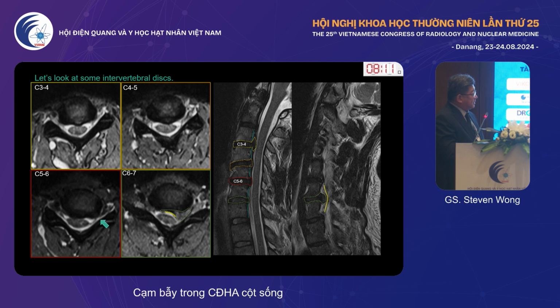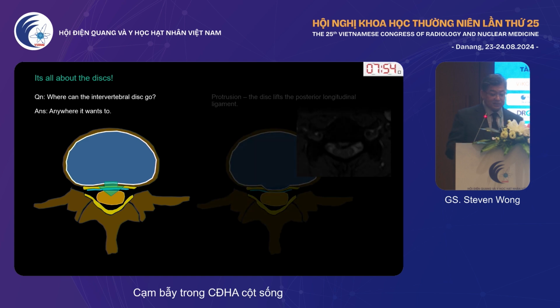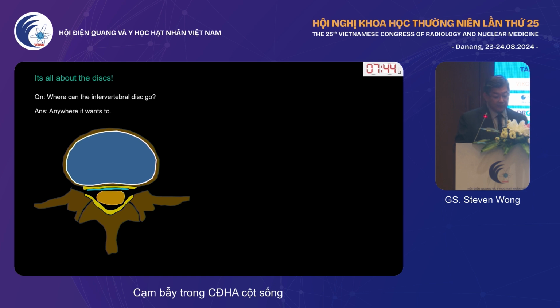All right, so in here, sometimes you have narrowing of the neuroexit canal by osteophytes and other entities as well. Right, so the disc will go wherever it wants to go. Most times it just goes anterior, posterior, beneath the posterior longitudinal ligament. I will call it a subligamentous disc protrusion. Nothing to worry about, okay? Just report it, surgeon's quite happy.